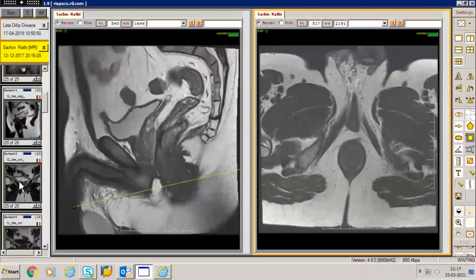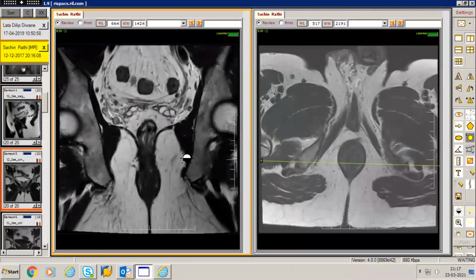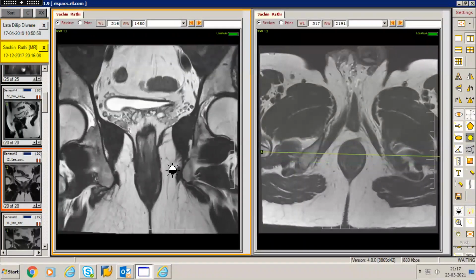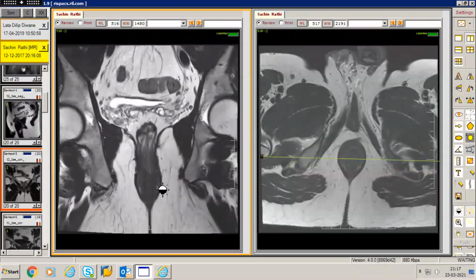All of us can appreciate the same thing in a much better way on the coronal view. So I'm just trying to show the same thing over here. Yeah, so now this would be the outermost fibers of what we call the external anal sphincter. What you're seeing here is the internal anal sphincter. Between the two is this thin, slender fat or potential space called the intersphincteric space. As we go slightly superior to this would be the puborectalis muscle. So what we appreciate here is the puborectalis muscle. And of course, the most important pelvic floor muscle, which is the levator ani itself.